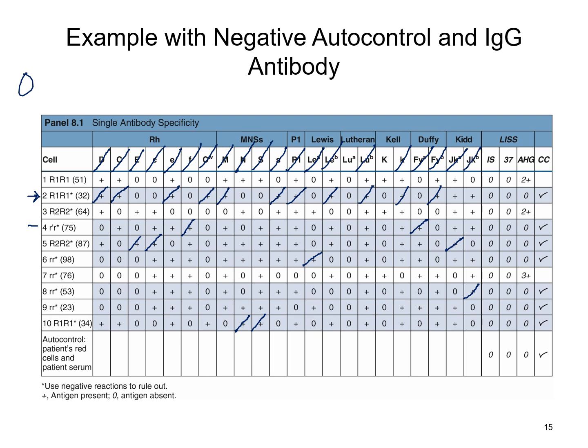So if we go back and look, we've gone through and ruled out about everything we can. The only things that we are left with are Kell and Lutheran A. Now again, I mentioned there's no antigens present, so we know if none of these donors had the Lutheran A antigen, it's not likely that the Lutheran A is causing any of this reactivity. I'm going to rule this out based on probability.